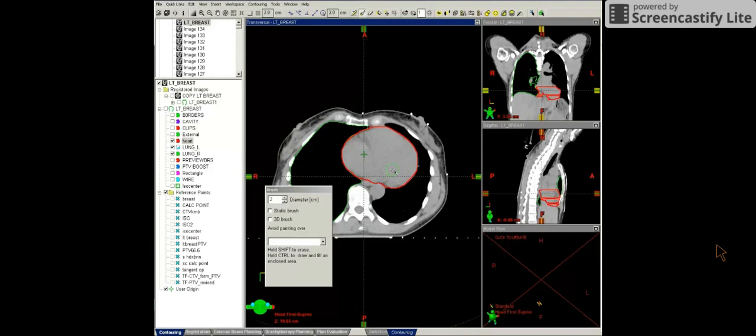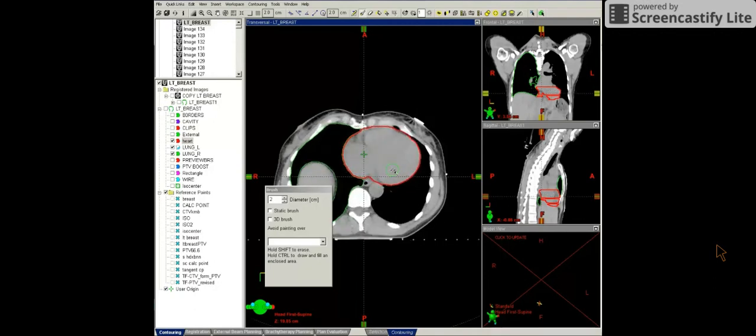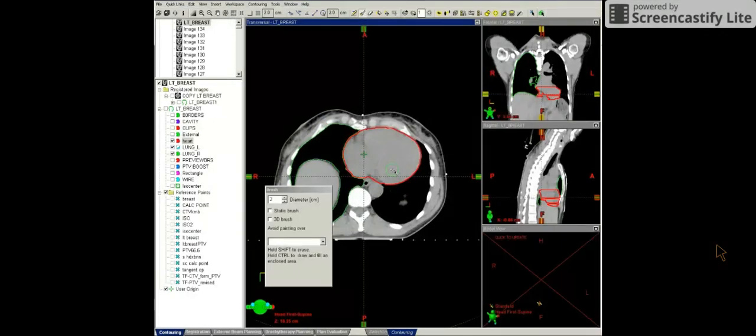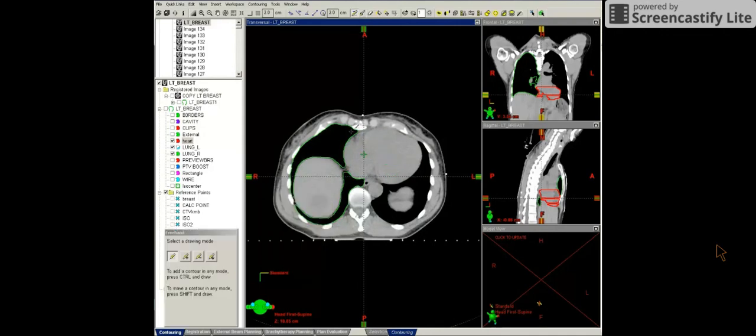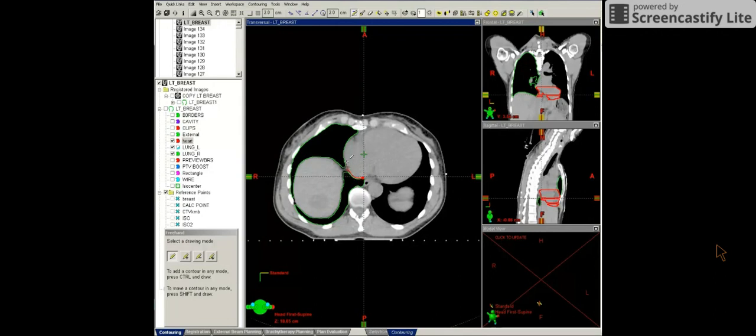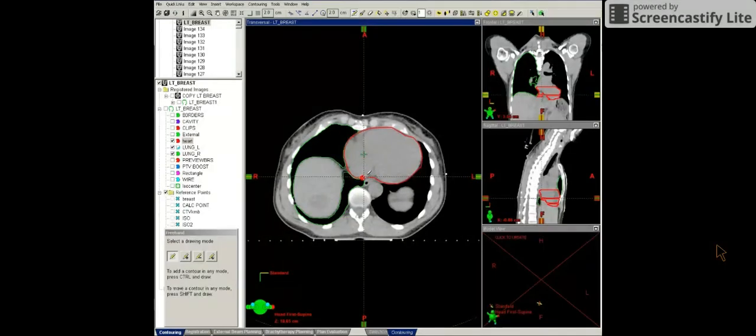Let's keep going inferiorly, looking at the heart contour. I can also use the pencil tool to contour the heart. So I'm just clicking around the heart with the pencil tool. And once again making sure not to include the esophagus.